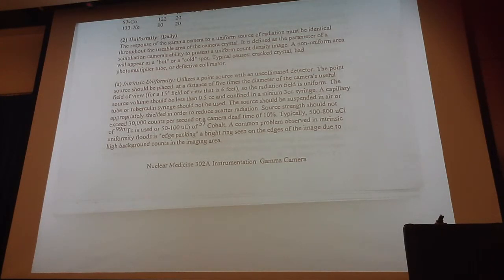Okay? Over my daughter's place, these guys left germanium rods out, just sitting in the hall. You know what germanium rods are used for? 68 germanium. So if you were walking down the hallway and you saw them, you wouldn't be concerned. Oh, look at that. Somebody left their germanium rods out in the hall. Okay, that's what we use as the transmission source for PET scanners.